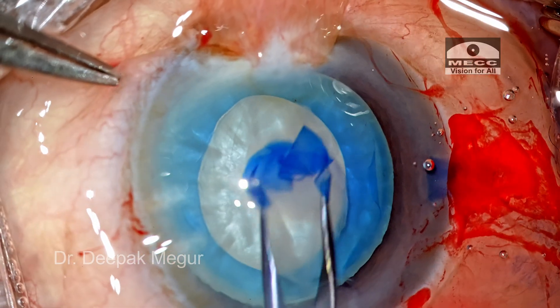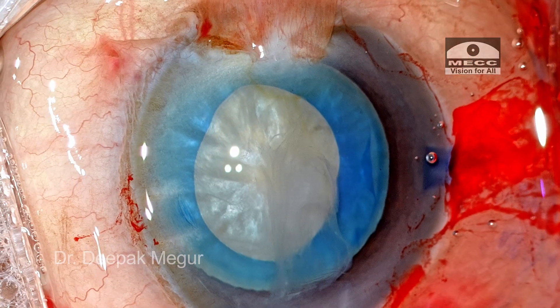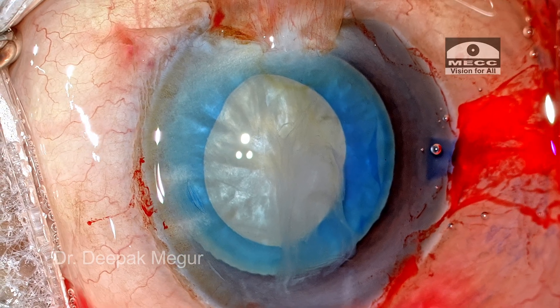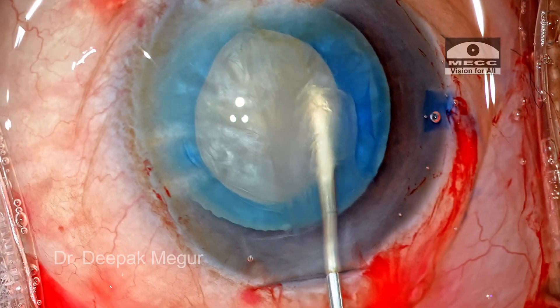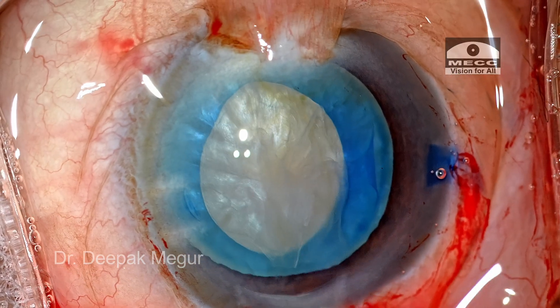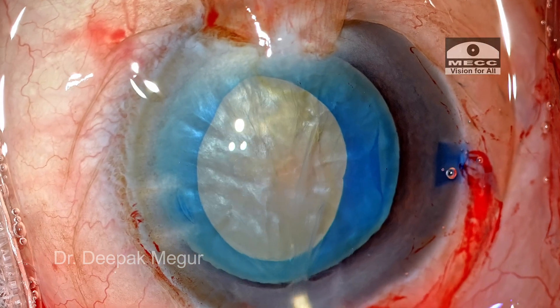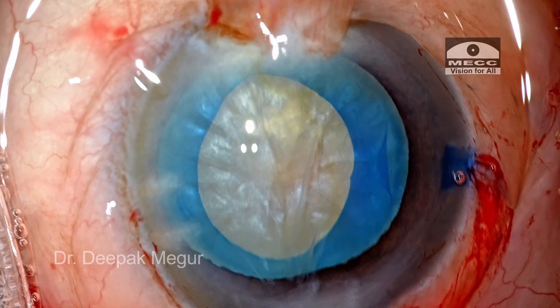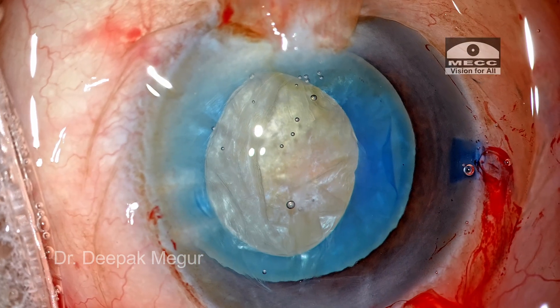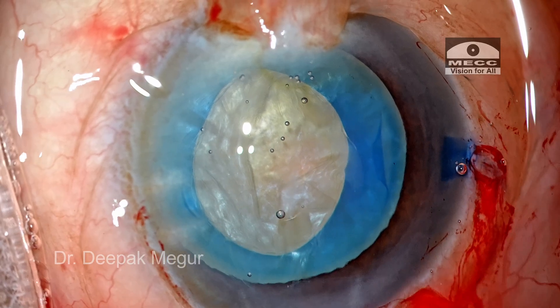I have a capsular opening which is about 5 millimeters in diameter, maybe slightly oval. The point I want to emphasize is that if you have a soft eye in these intumescent cataracts, the rhexis becomes relatively much more predictable and well-controlled. I would always prefer to use means and methods to ensure that the eye is soft before performing the rhexis.